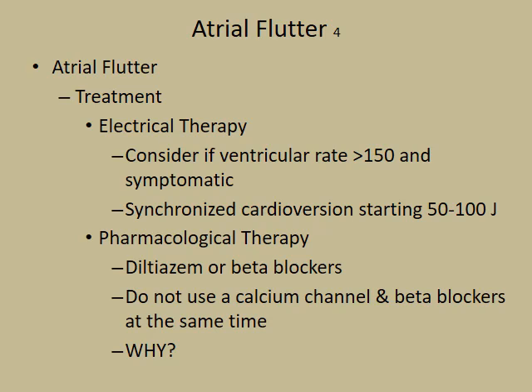Treatments for A flutter. Remember, if they are fast and unstable, they get synchronized cardioversion. So with A flutter, you're starting at that 100 joules. Remember the steps for synchronized cardioversion. You're going to sync, which means turn it on. You're going to set your energy for 100 joules. You're going to charge your monitor. You're going to clear the patient. You're going to push and hold that shock button.